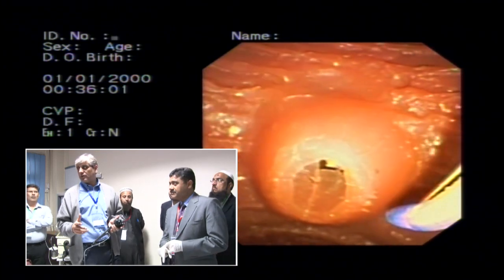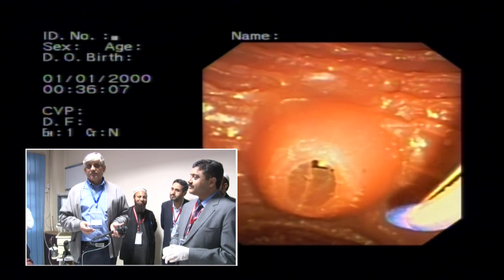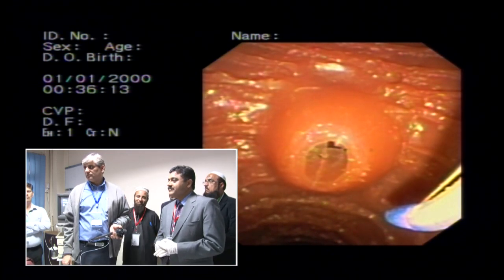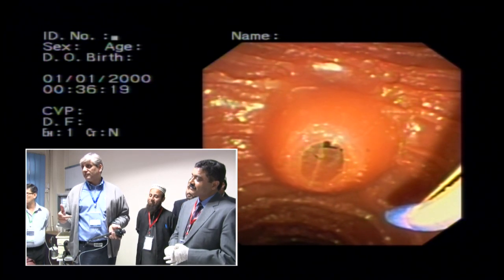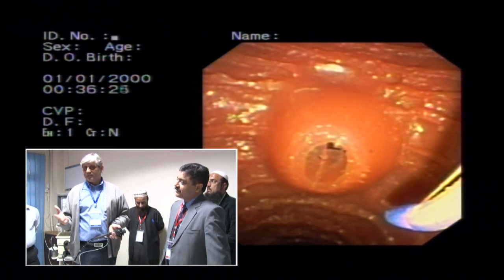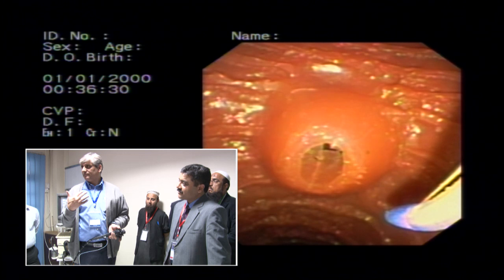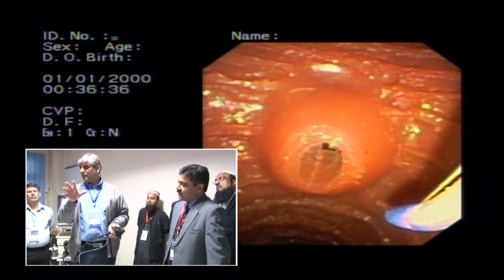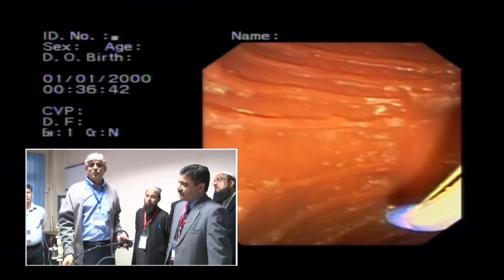One of the things that happens quite often is we have patients with ampulla ही नहीं मिला. Why do you think that happens? अगर एम्पुला नहीं हो और डॉक्टर खालिद ने देखा नहीं है तो मैं मान लूँगा but he goes in, he looks at it, he spends some time, washes the whole thing and finds it. I find X-ray very useful. When I have my right position, I have difficult ampulla, किसी ने बोला नहीं मिल रहा, quite often we just look at X-ray. I know I'm in the right position. So you just need to do this.